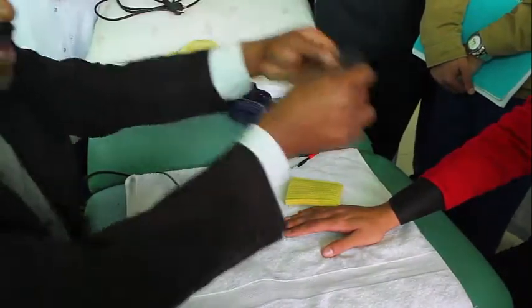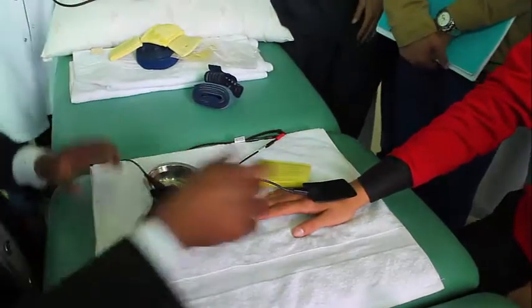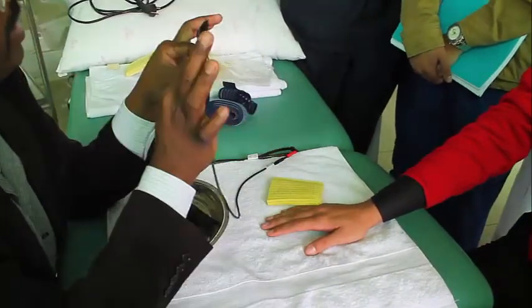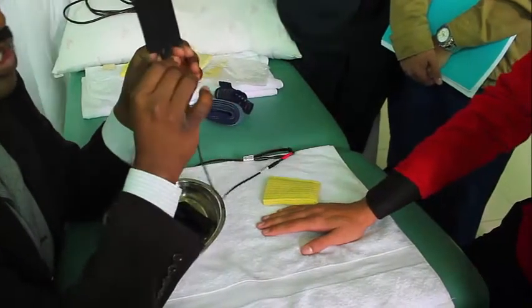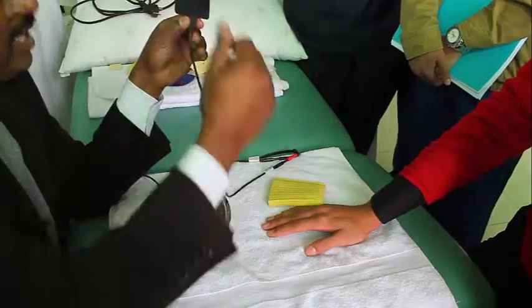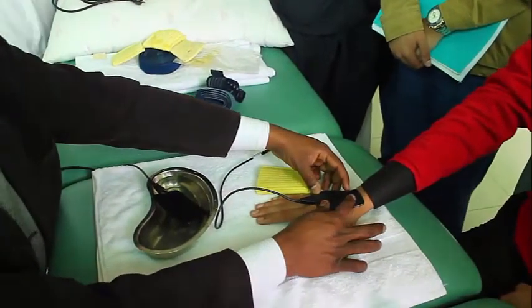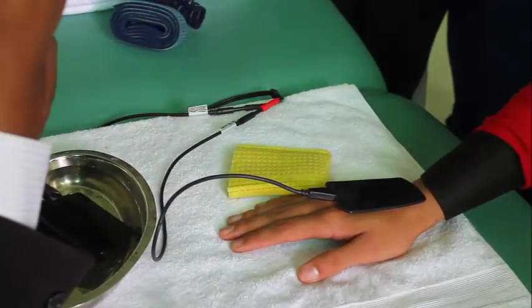Some electrodes come with a gel coating, so you just press it onto the skin. That's it, without water. If there is a gel layer, then directly you can apply. Or if you don't have a gel layer, you have only the electrode, at that time you apply liquid gel, like in ultrasound, when they do ultrasound they apply gel. Similarly you apply gel here and keep the electrode on the gel. Gel is good. So this is the second way of decreasing the skin resistance.